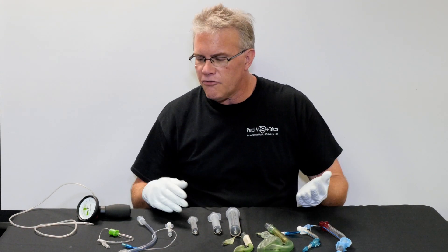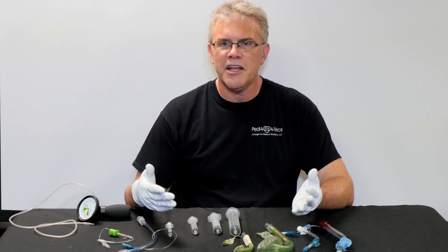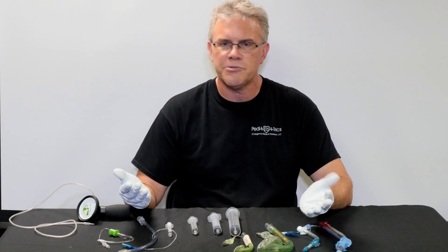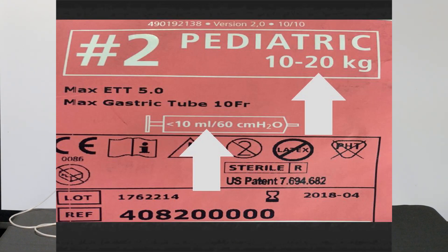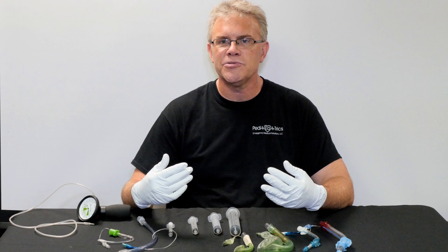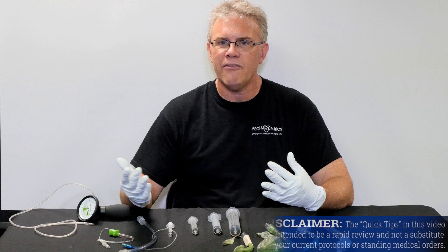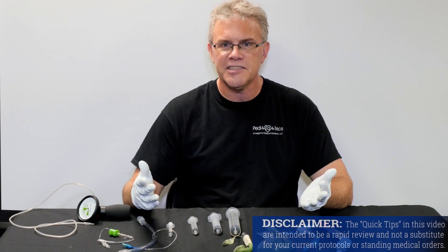The first tip involves when you're going to inflate. Remember from a previous Give Me 5, when you're trying to figure out how much air for a King or an LMA, all you have to do is read the package, because on the outside it says how much air to inflate with. Now, just like when you're giving medications — as a rule, we never give a medication that you didn't personally draw up out of the bottle — the same idea applies here.